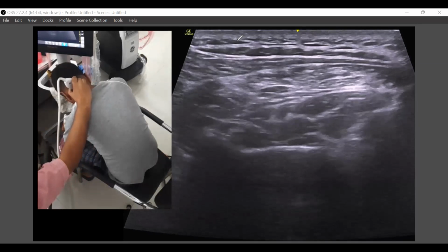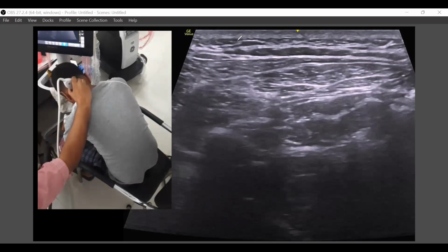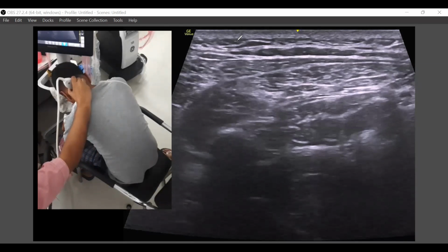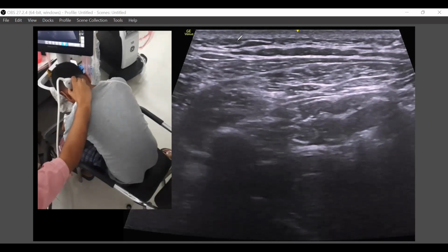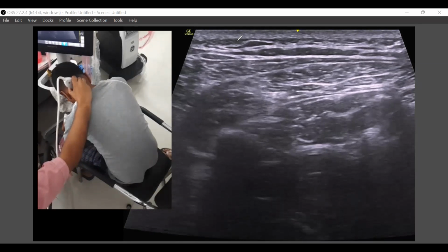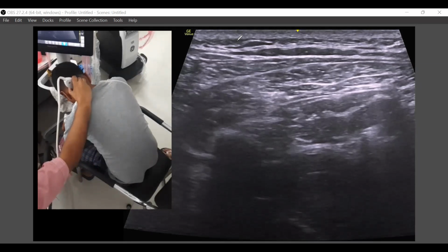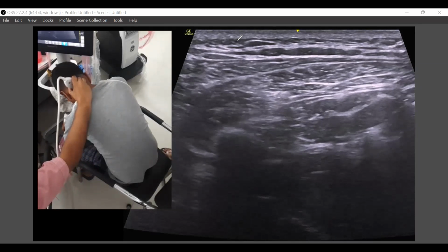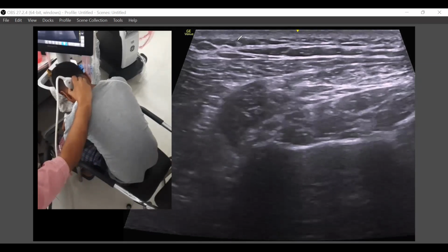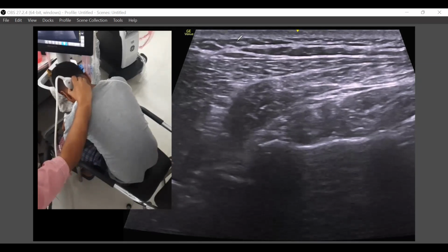You see here, so what is important here? You see, this is the articular pillar. What I have learned just now is that the facet joints are situated over the hill, over the top. So at this position, that is the joint position. Though we cannot see the joint at this angle, if I am coming down, you see the hill is converted into valley. So it is now valley.